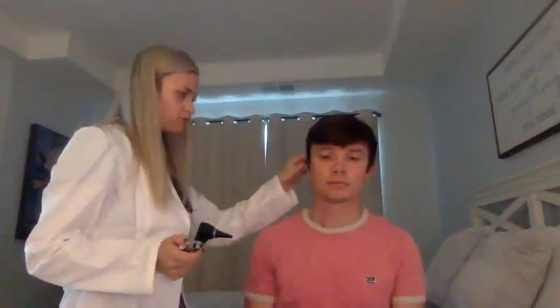Now I will be moving on, and I will be inspecting the ears. I will look at them bilaterally. I note that they are symmetric with no obvious lesions or discolorations or nodules. Now I will be looking inside the external auditory canal and at the tympanic membrane using my otoscope with the light turned on. Scoot up just a little bit for me, please. I will pull the pinna up and back to better visualize.